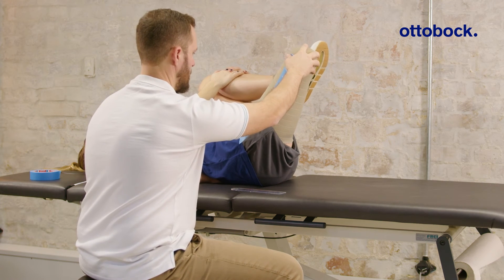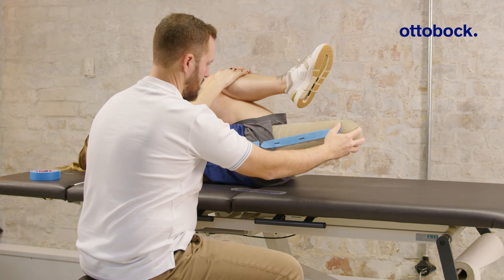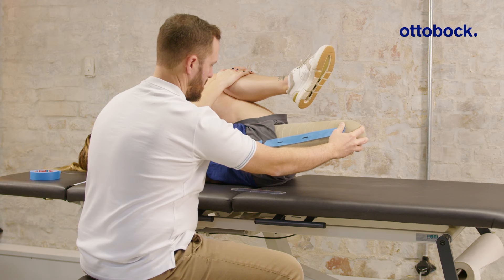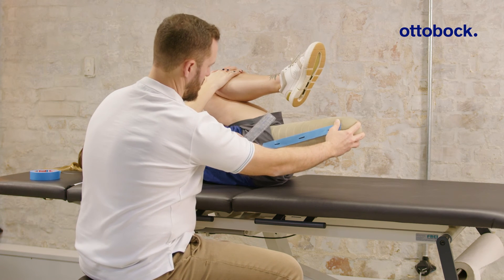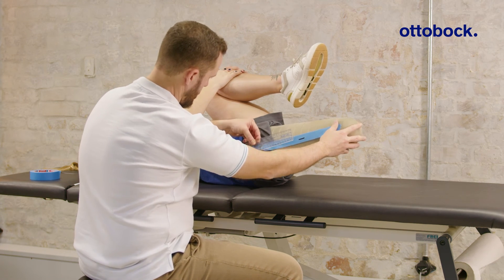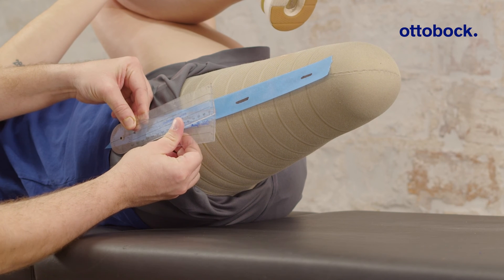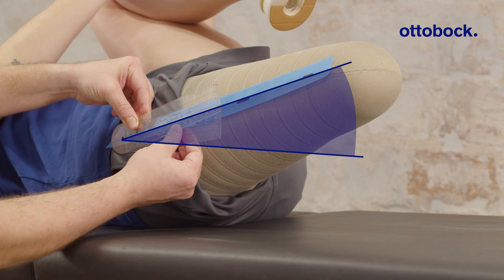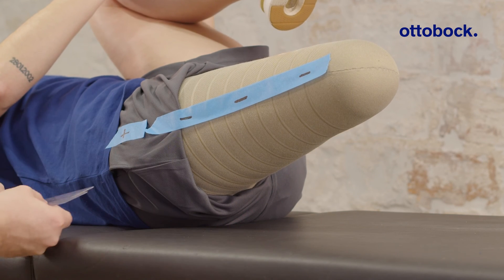Push the residual limb into adduction and move it up and down. Then lower the residual limb into hip extension until you feel the pressure on your hand reducing below the lumbar spine. This is the angle at which the compensation movement starts. Now measure the angle between the residual limb and the treatment table. Repeat this procedure a few times and use the average of the measurements to get the final result.